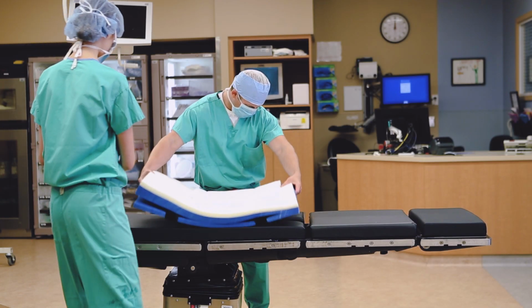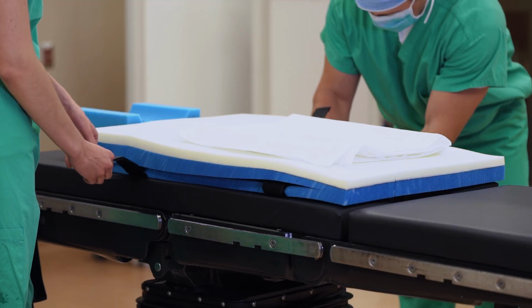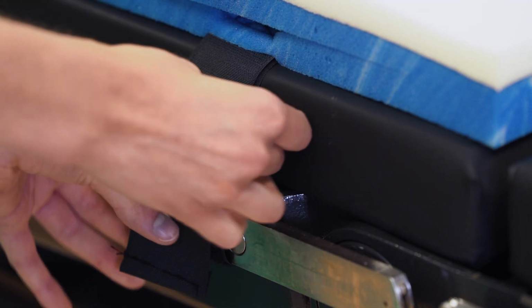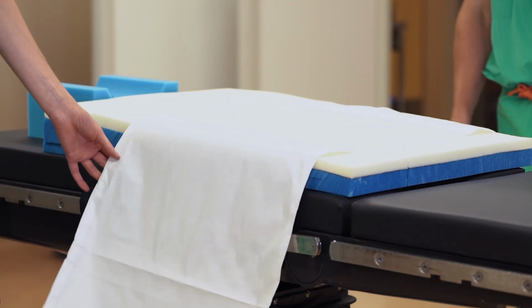First, place the graduated foam pad on the table as shown. Then attach the black fastener straps to the bed rails by looping the straps under the rail and affixing the end of the straps to each other. You may then unwrap the sheet and add a headrest if desired.